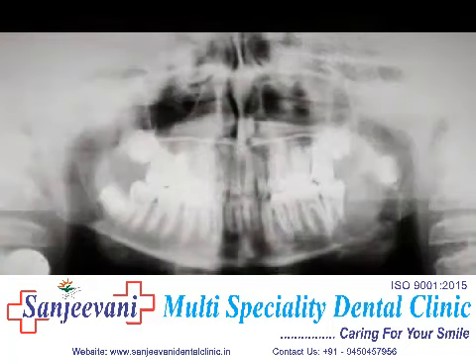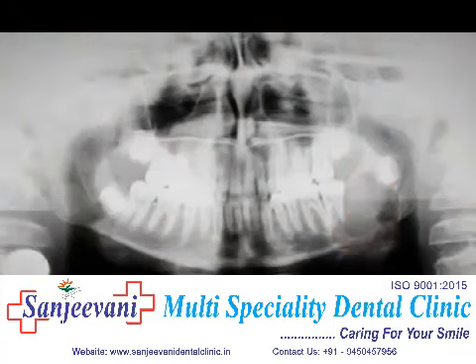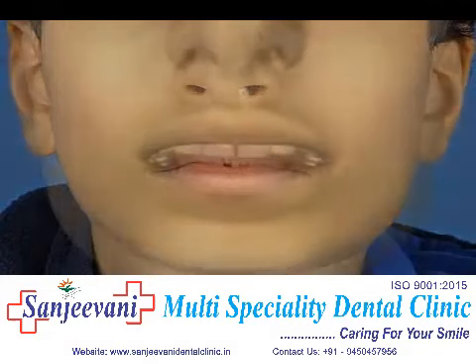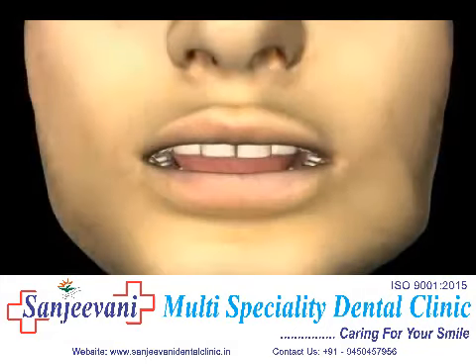In the picture, you see a skull X-ray, and in the lower jaw, left, you can also clearly see a swelling, a so-called follicular cyst. The cyst is too large to be removed as the lower jaw could be broken. The size of the cyst can also be made out from the outside due to the deformed tissue. A cystostomy will first be carried out.